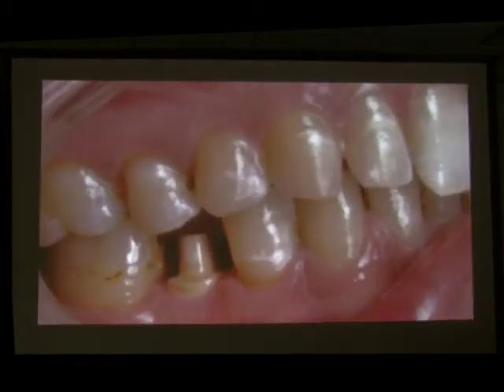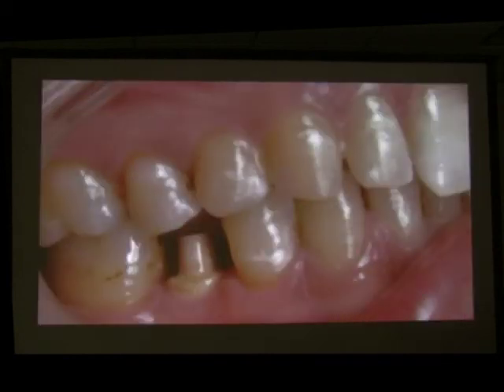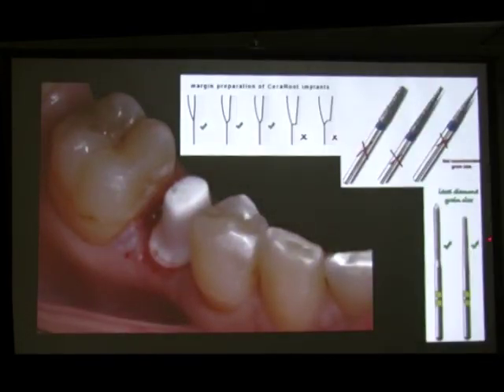So the patient comes 4 months post-op, and even if the implant has become yellow, stains, any type of wine or tea, or sometimes chlorhexidine, leave the implant. In this situation, it turns dark. If we don't want to have this margin exposed, we prep the margin. But we don't prep the margin with the same inclination. What we do is we bevel this corner, and this is the type of bur that we must use.